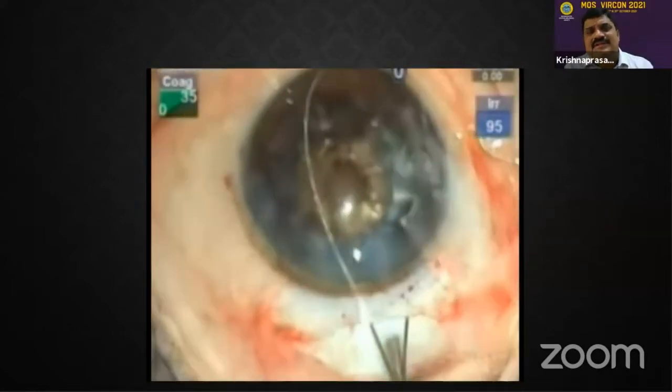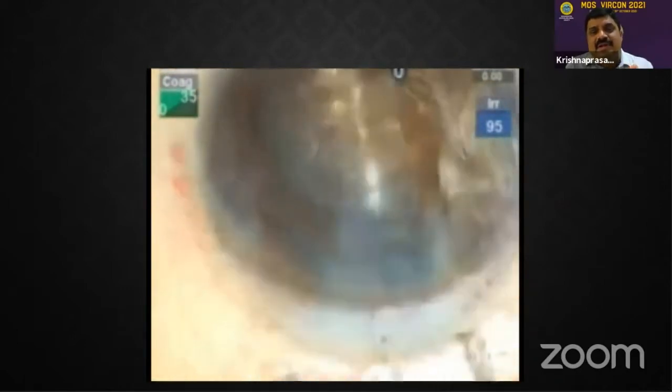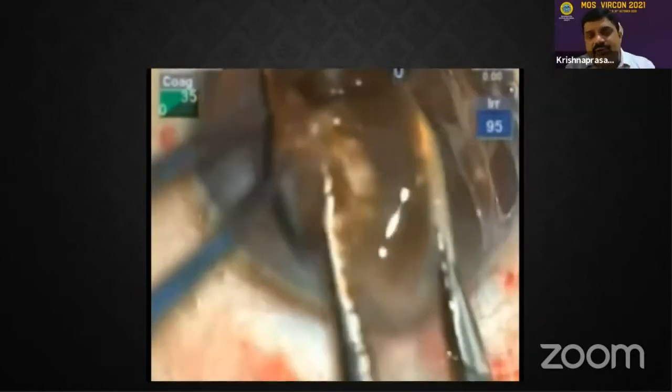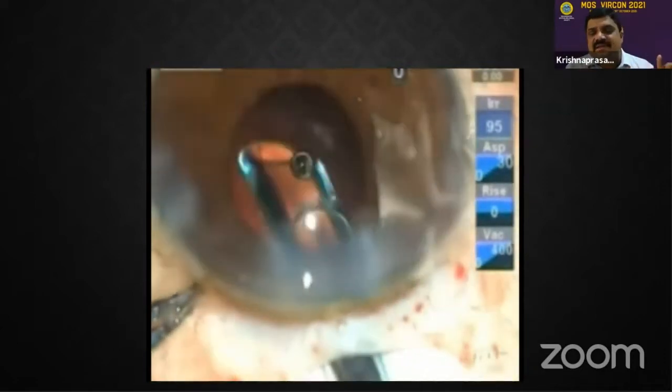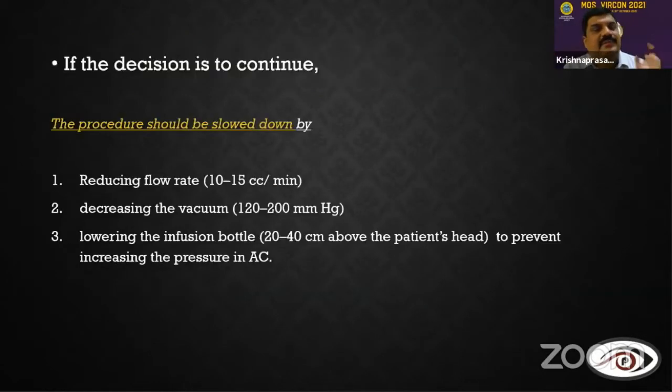Well, some of our friends even use a snare within the anterior chamber to cut this huge nucleus into smaller pieces. You can take out piece by piece, or you can even use other equipment to cut the nucleus, do a good vitrectomy, then put the lens within the sulcus. This is very important to convert. With a PC tear and retained nucleus material, you can continue the phaco once again, depending upon the type of nucleus remaining.